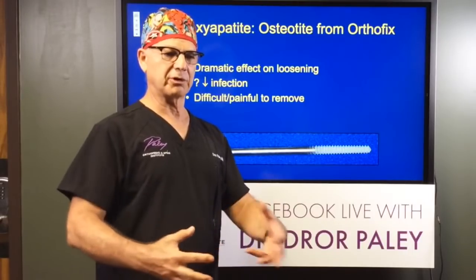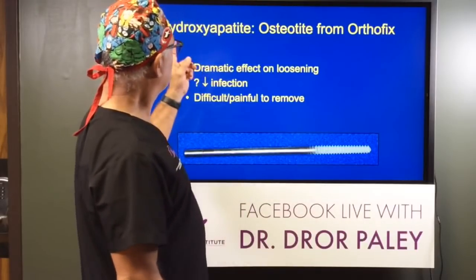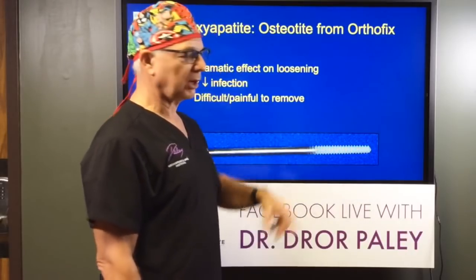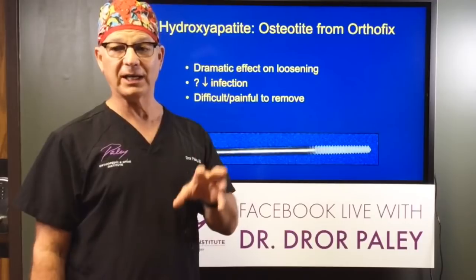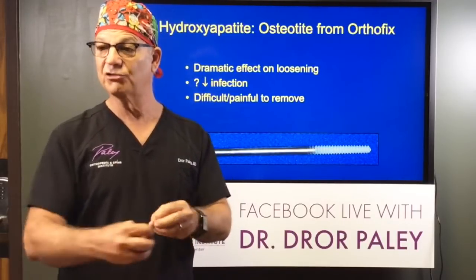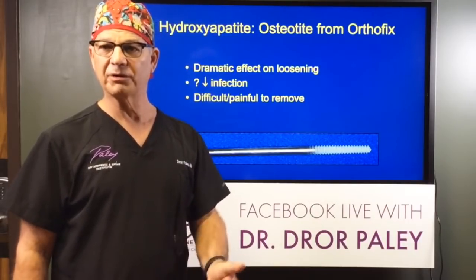And then the latest and the greatest are these. This goes with the Orthofix system, which is that system I just showed you, the ring device that we use. These pins have a lot of really cool features, but not only is the HA coating on the threads of the pin, it also comes out through the skin. It turns out that the soft tissues like it too, so they grow into it, instead of a shiny metal surface that the soft tissues can't attach to like the skin, which leads to infections.